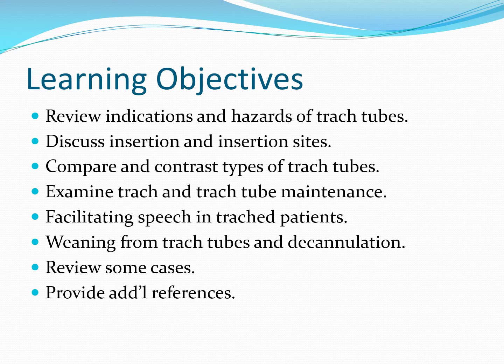In addition, we'll examine the trach and trach tube maintenance. So that would include maintaining the stoma, making sure that it's clean, making sure that it doesn't appear infected. If it does, that the patient gets the appropriate treatment to treat that infection, if you will. And the actual maintenance of the tube itself and the retaining device, the drain sponges that capture any leakage or mucus, etc. Very, very important to keep that site clean and well maintained.